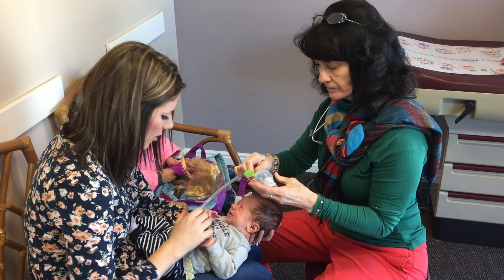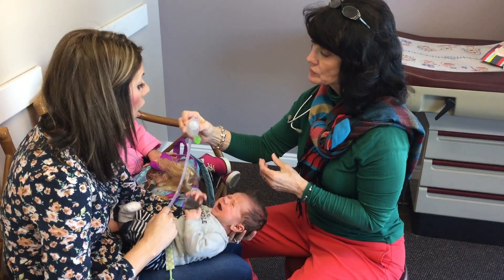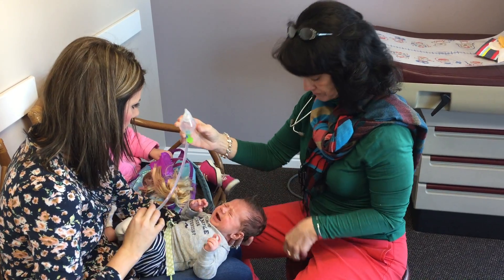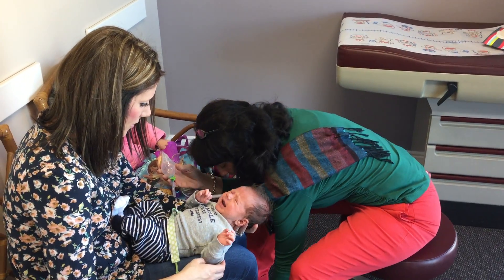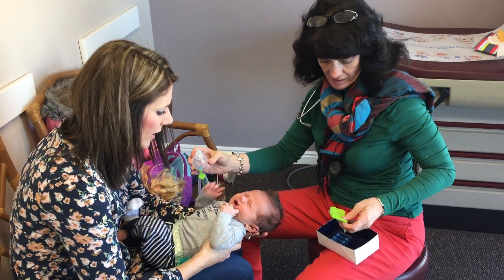So you don't have to squeeze it at all — you just put it in and suck it. But you can use it both ways if you want to squeeze it, so that's a great thing about it. And then it has this nice little bag, so you can just carry it with you in your diaper bag and put everything in there.